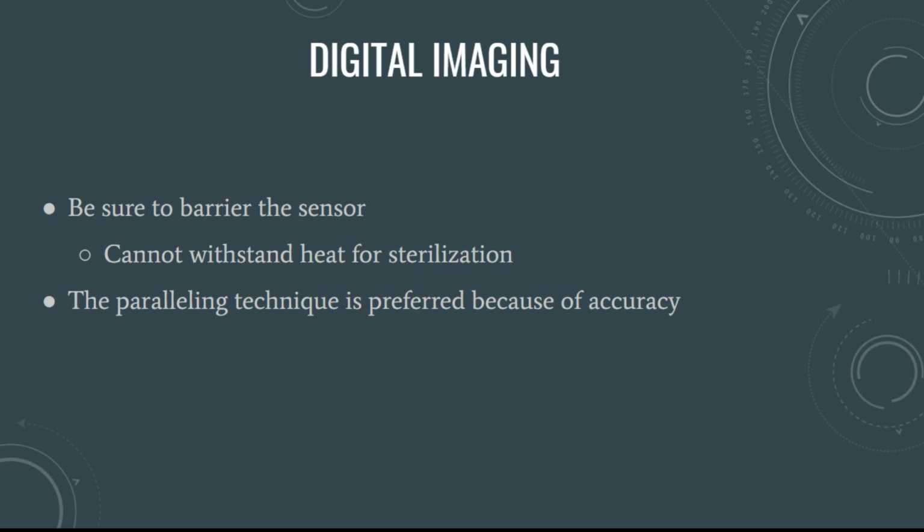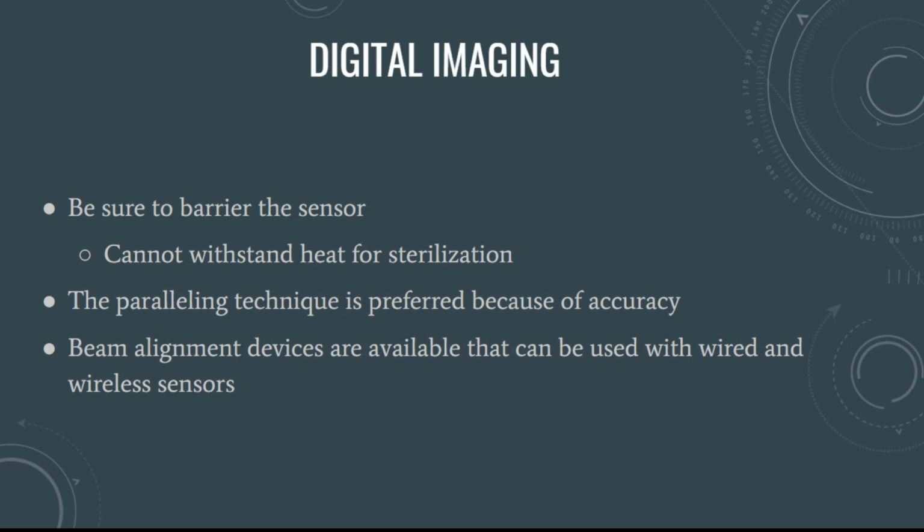With digital imaging, a lot of times the paralleling technique is preferred because there's a little bit more accuracy with it. And beam alignment devices are available that can be used with wired and wireless sensors.